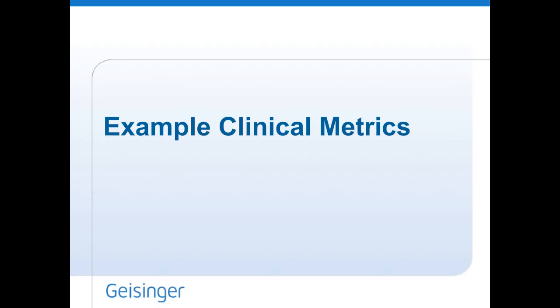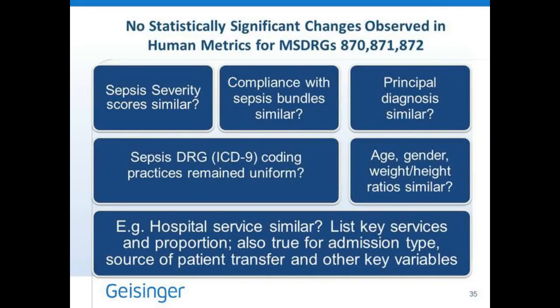Now, the last thing I want to talk about are metrics that can be used as a control for bias of your experiment. These are things that are harder to get. For instance, though, if you are reporting to your upper-level quality folks, you want to be able to make sure you're telling them that the sepsis severity, the MSDRG 870, 871, and 872 are similarly matched in your pre-intervention and your post-intervention cohorts. So that is your historical versus your, after the new method or the new blood culture instrument kind of data. Was the compliance with the sepsis bundle similar?